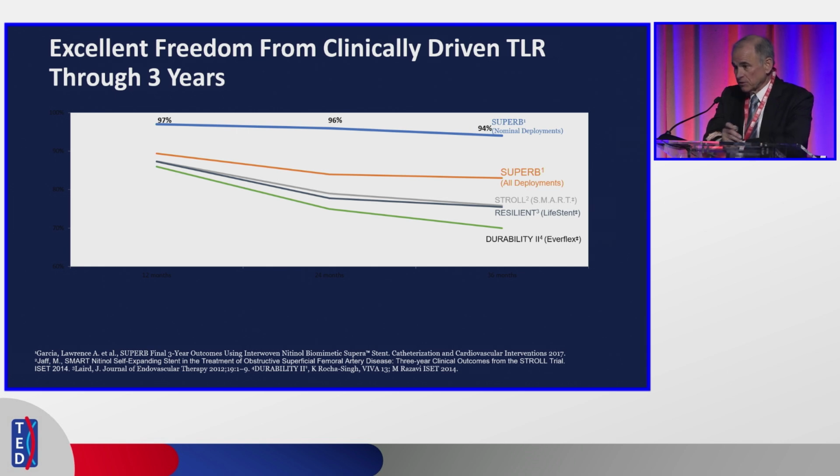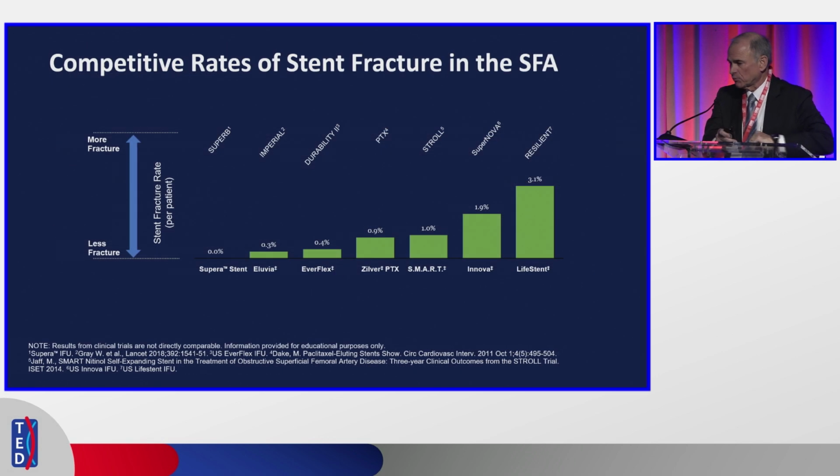If that happens, results are great. However, sometimes these come out twice as long as the intended length, and then you lose the radial force, you lose that geometric arc, which is what creates the radial force here, and you lose some of the flexibility. And where people have had problems with these, they put them in wrong.